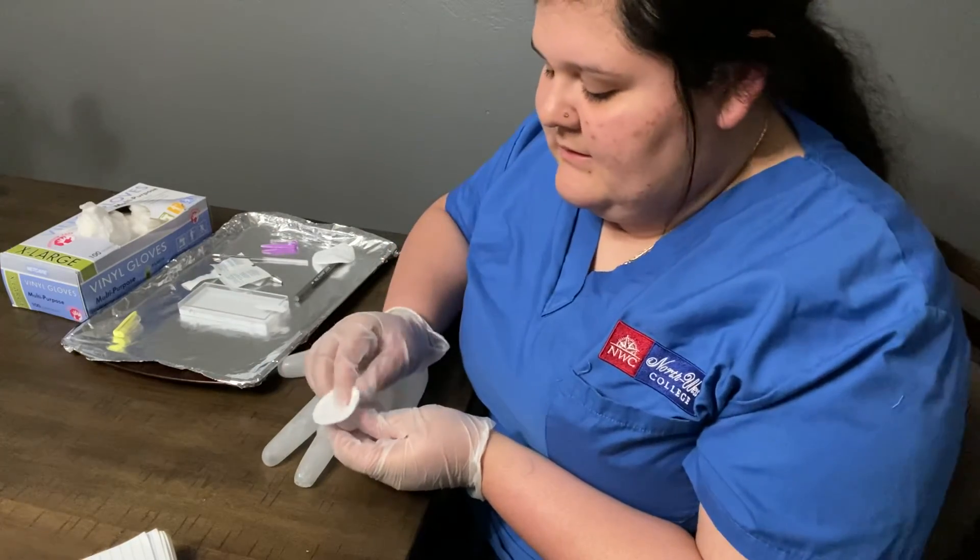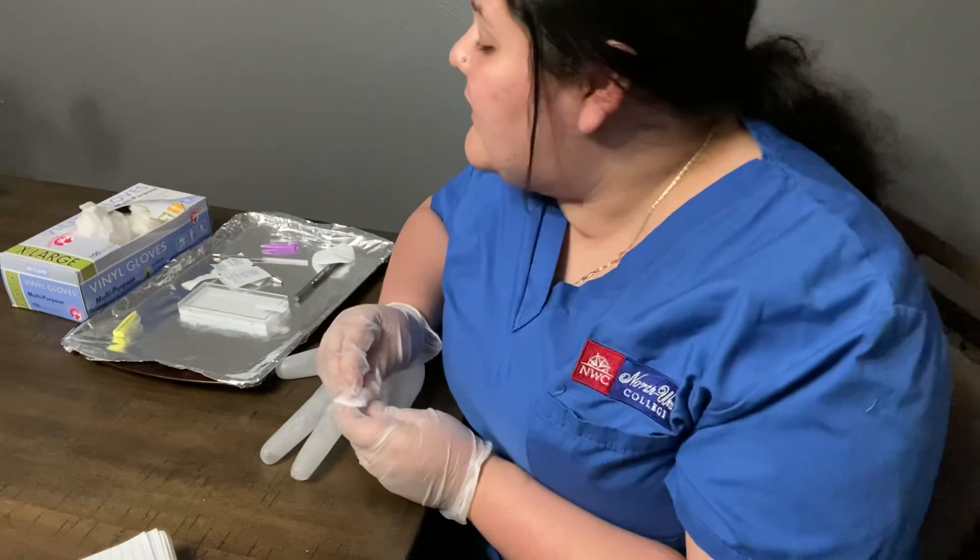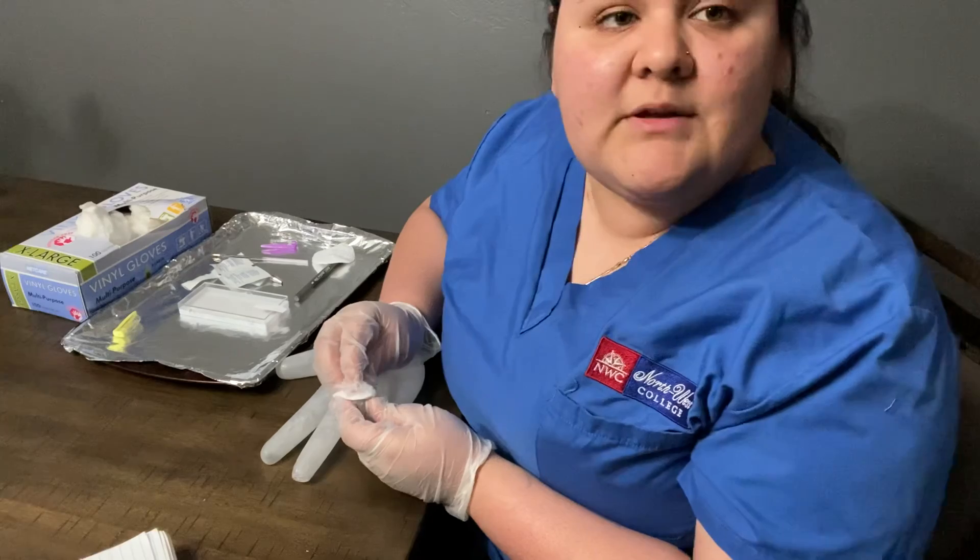Then you're going to want to give the patient a little gauze for them to hold. The patient's going to hold it, and then once they're done, the reading's going to come up and then you're done with your test.